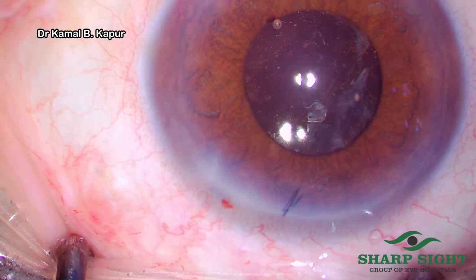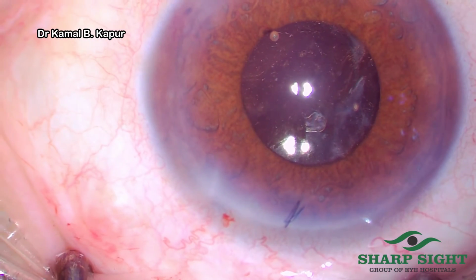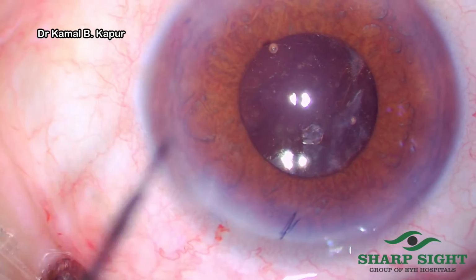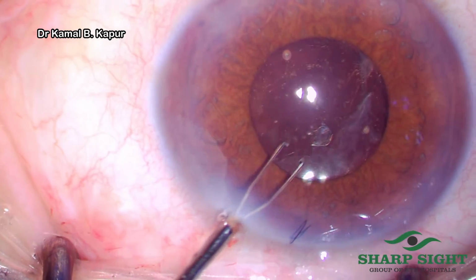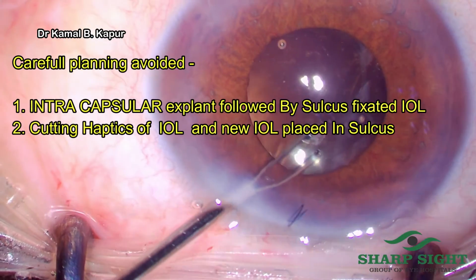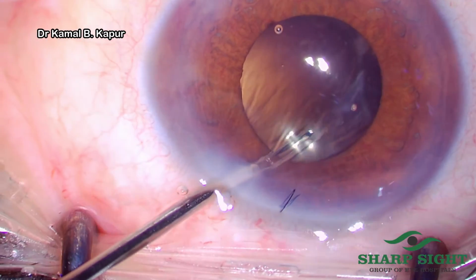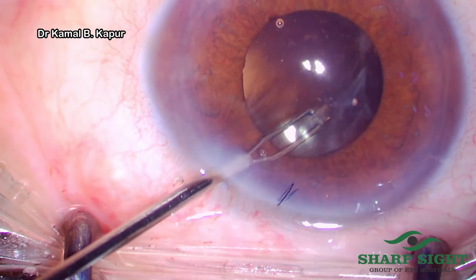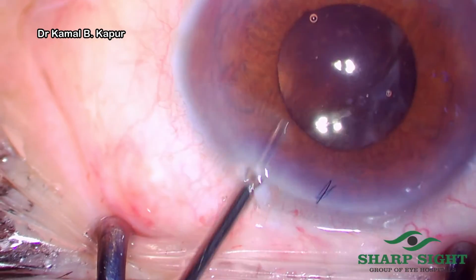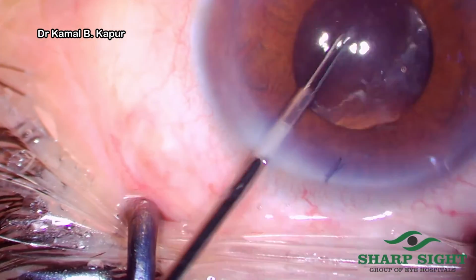Now this whole procedure has shown us one thing, that we need to imagine in our mind all the forces which could be decentering the lens. Doing this maneuver has ensured that we have avoided explantation of this lens, which in case of a complete fibrosis would have resulted in an intracapsular delivery and we would need to go ahead and put a sulcus fixated IOL, or a second option of cutting the haptics of the IOL within the eye and then placing a new lens within the sulcus.